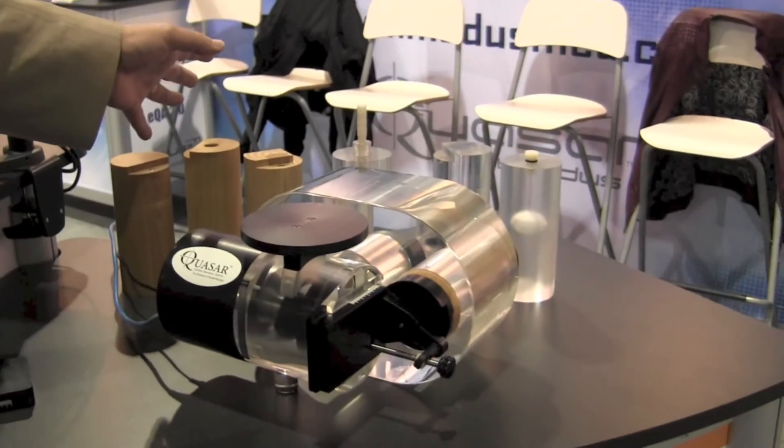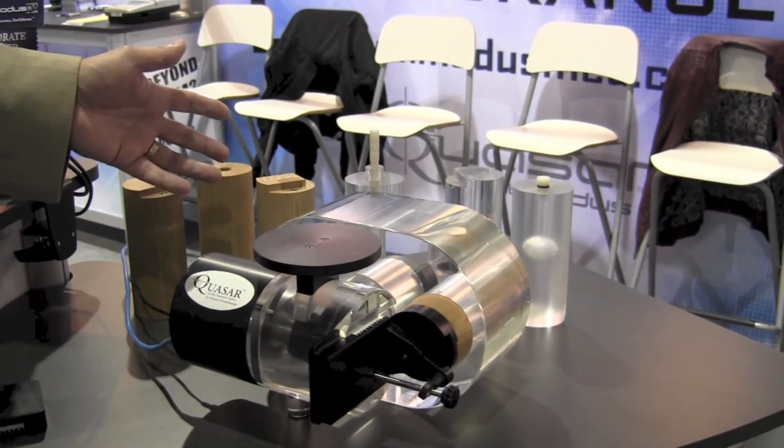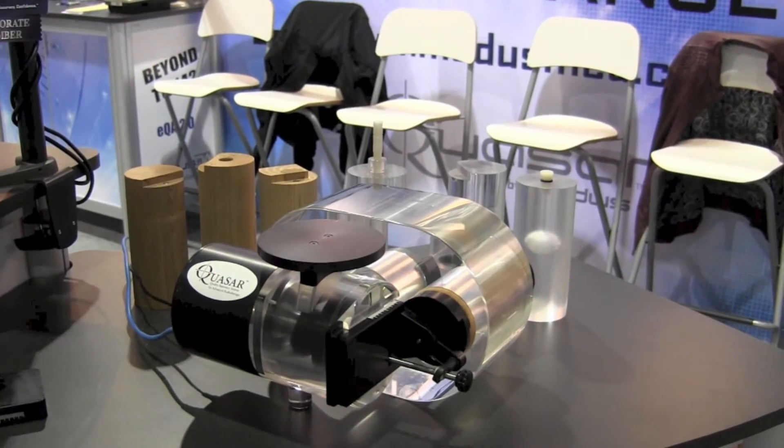We have inserts for imaging, for 4D CT, 4D PET CT, for dosimetry, ion chamber and film dosimetry. And all of this can operate under computer control.